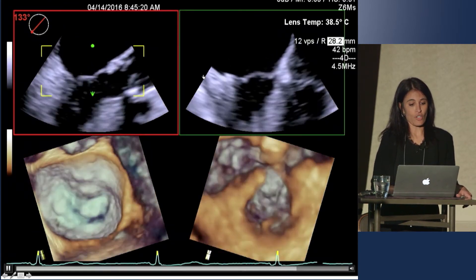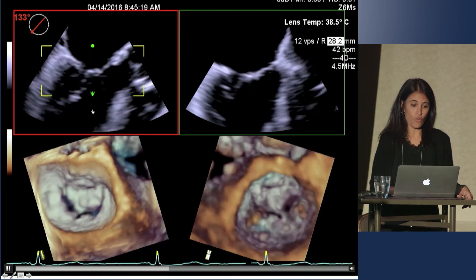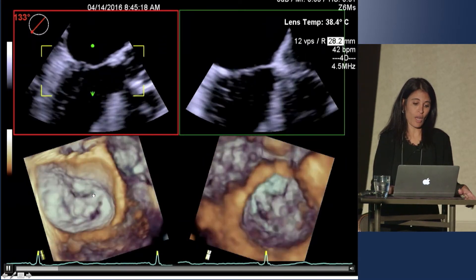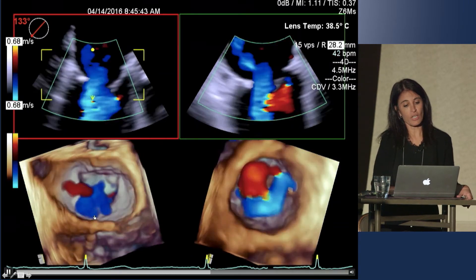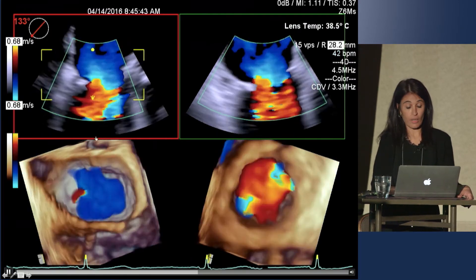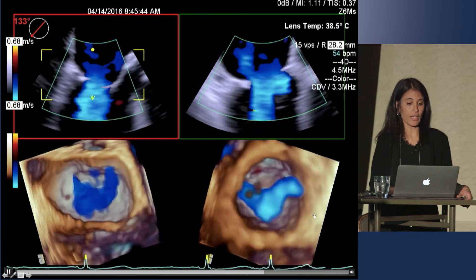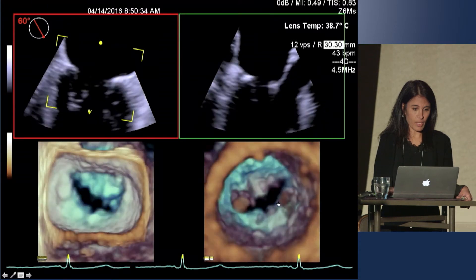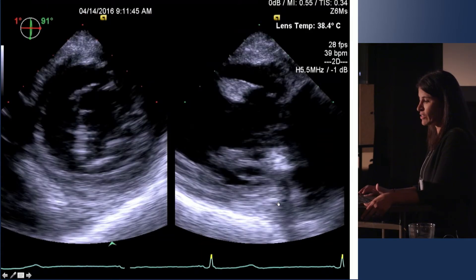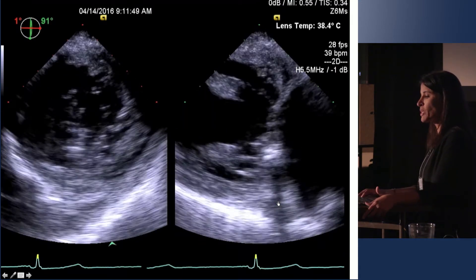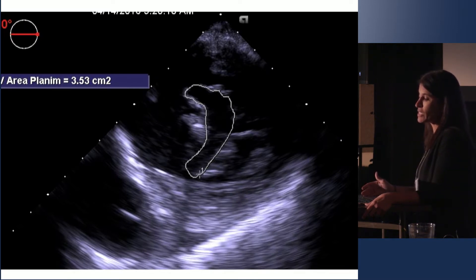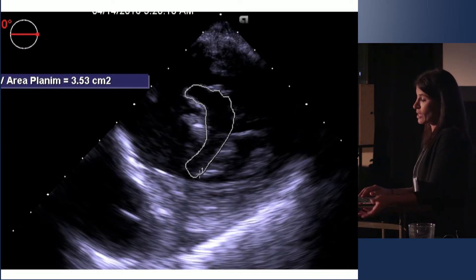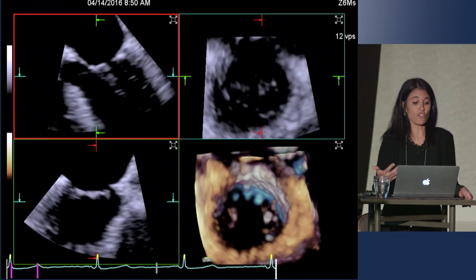Going through the workflow, we have our Dart here with the Siemens platform where you can basically center your eye over the coaptation line of the mitral valve. You can see very restricted posterior leaflets with some anterior override. More importantly, you see the color flow — you have severe posterior medial eccentric MR on the LV side, and you see the flow convergence telling you that you also have significant MR. With our anatomy in place, we went ahead and did some other measurements. In transgastric views, assessment of 2D with planimetry is probably underestimated because you don't know where in that valve orifice you're truly getting the valve orifice measurement.